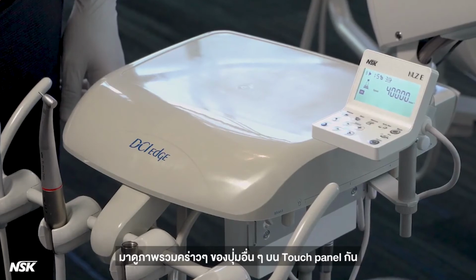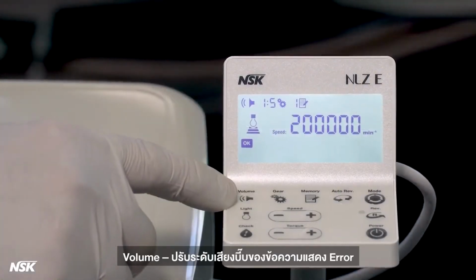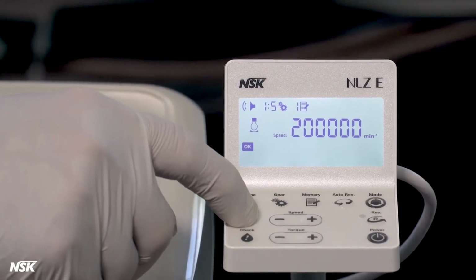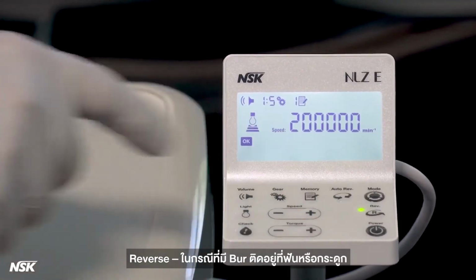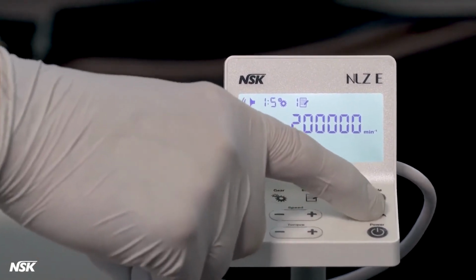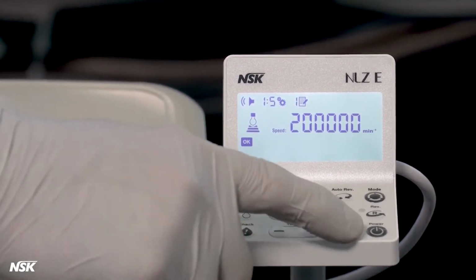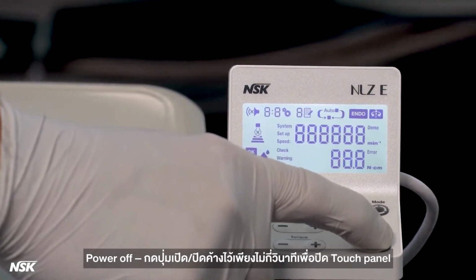Let's do a quick overview of the other buttons on the touch panel. Volume. This adjusts the level of beep sounds of the error messages. Light. This adjusts the intensity of the light. Reverse. In the unlikely event a burr is stuck in the tooth or bone, choose reverse direction to reverse the motor and free the burr. Check. This runs a quick status check on the attachment to see if service is necessary. Power off. Press the power button and hold for a few seconds to turn off the touch panel.